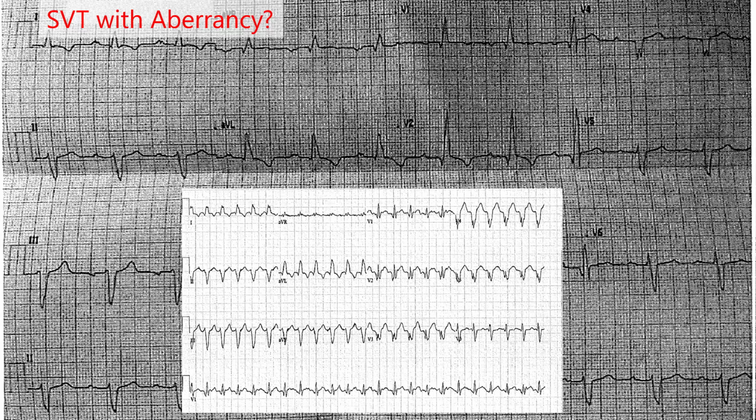There's always going to be some variability in how these things are placed between patients and even in the same patient on a different day by a different technician, et cetera. They may be placed in a different spot, which may lead to some of these variations in the QRS complex. So it can be a non-specific finding, but definitely worth looking into.